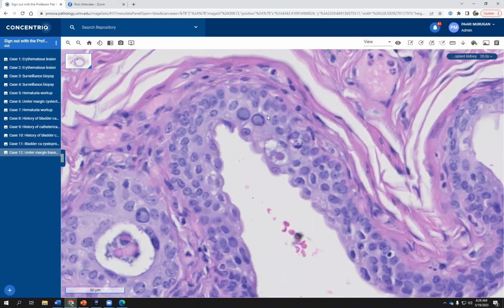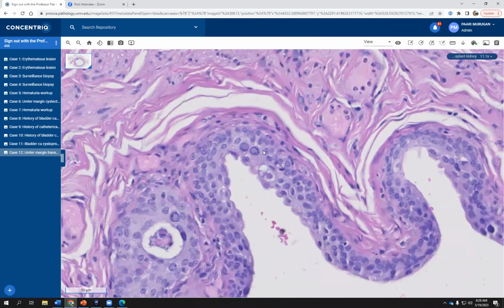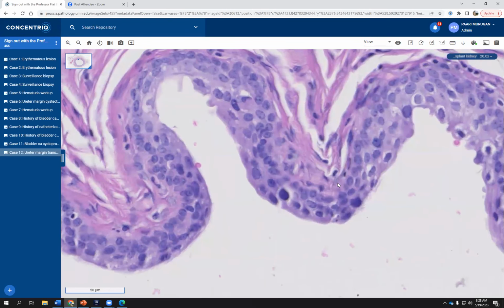And of course, this is a transplant patient, so they are immunocompromised, so they have a higher incidence of BK virus infection. This is a classic cytopathic feature of viral infection where you see central nuclear homogenization with peripheral displacement of chromatin, which might sometimes mimic carcinoma in situ or atypia for the unwary, especially when you see such a hyperchromatic nucleus.